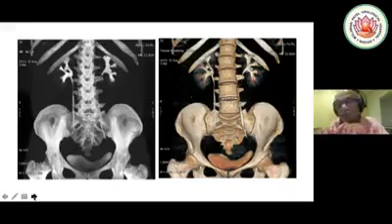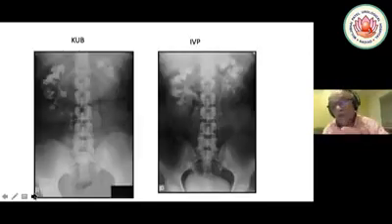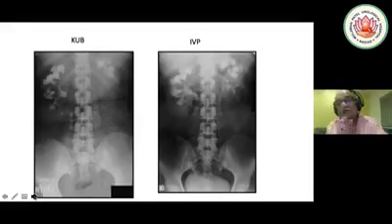Now, when you puncture and you see also, ultrasound will give you the direction plus you see, and that small stone will fragment with laser, which will come out into the calyxal neck and the infundibulum, and then clear the stone. So that is the planning. That flexible ureteroscope with a microperc. The problem with supine position in upper calyx, if you dilate, you will have a problem. If you don't dilate, you would not have a problem. I mean, you would be able to do the microperc, and then with a flexible ureteroscopy, with combination in supine position, you can do it.